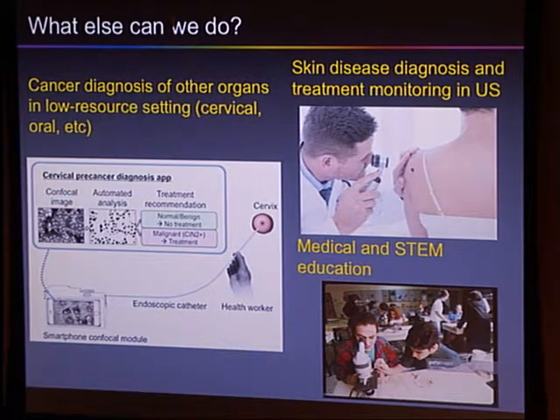But not only that. I briefly mentioned that even in the US, not many clinics actually use this in vivo microscopy device. And one of the main reasons is the cost, okay? So now, if we can make these low-cost devices available, then we can think about using them in rural clinics or in primary care clinics to screen very large populations and catch skin cancer at an early stage and then treat them accordingly. So that's really a big opportunity right there.